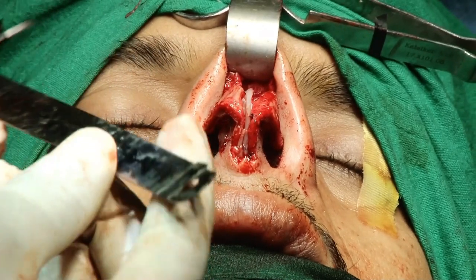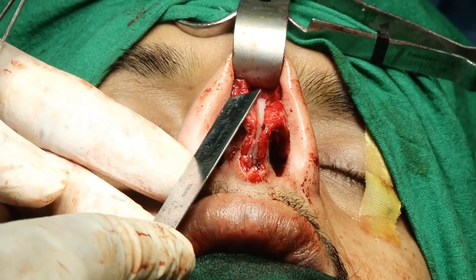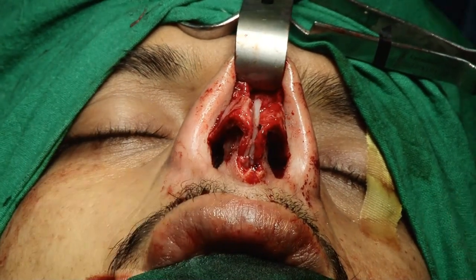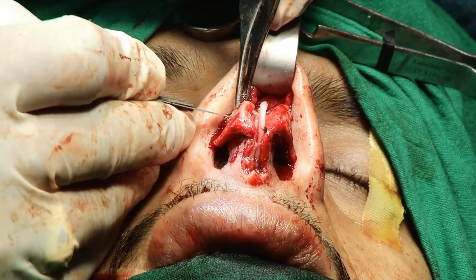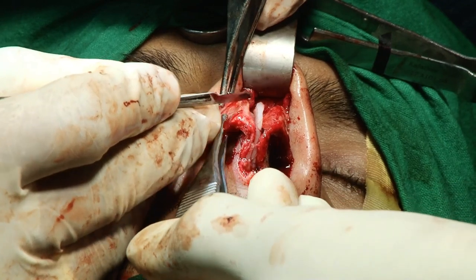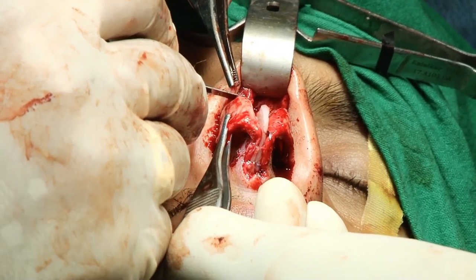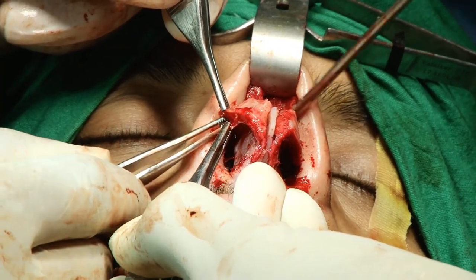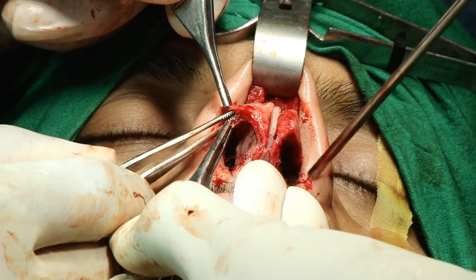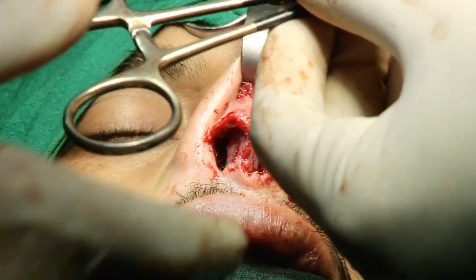Because the size of this lateral crus is too large, first I measure, and it is around 12, so I excise a little bit of the cephalic part, the cephalic trimming. It's also an important thing, like we discussed this morning: whatever amount you excise, whatever you preserve is more important. You always try to preserve at least 10 mm. It's a very easy method. Whenever you have some focal depression on this lateral crus, no need to flip the entire crus. When it is diffuse, then you need to. Now for suture, you can use a needle also for the fixation.